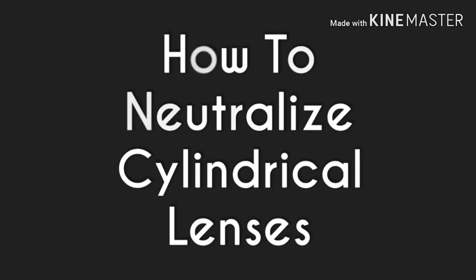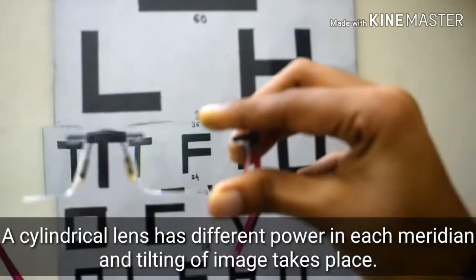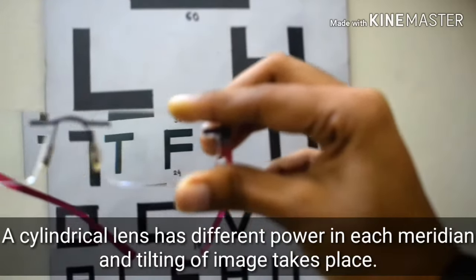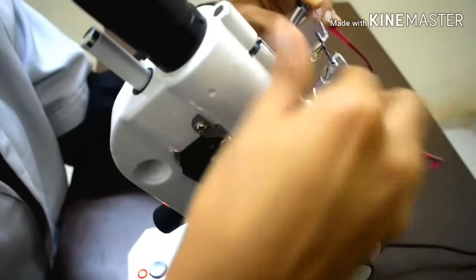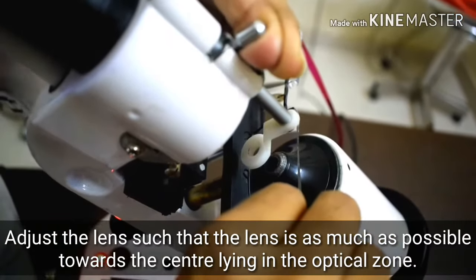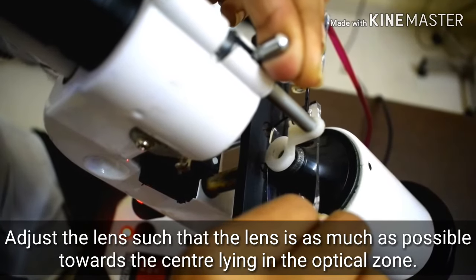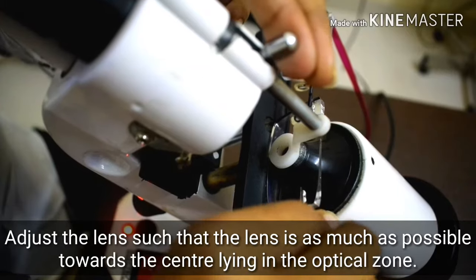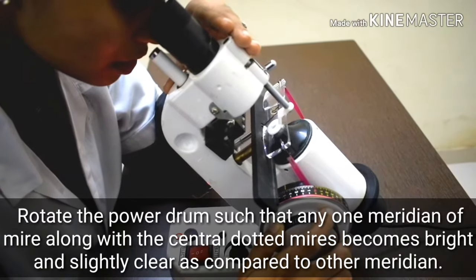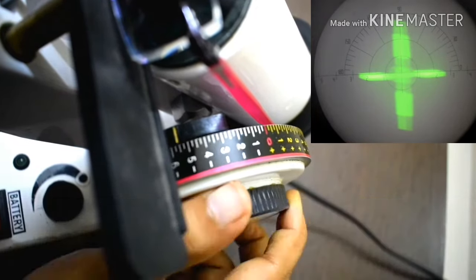How to neutralize cylindrical lenses. A cylindrical lens has different power in each meridian and tilting of image takes place. Adjust the lens such that it is as much as possible towards the center, lying in the optical zone. Rotate the power drum such that any one meridian of the mire along with the central dotted mire becomes bright and slightly clear as compared to the other meridian.